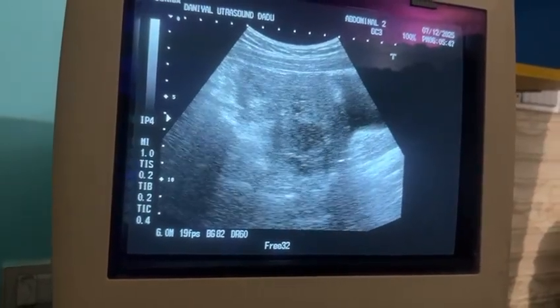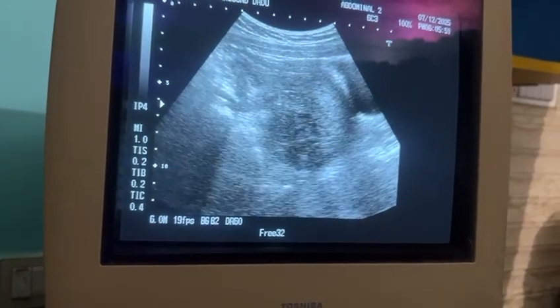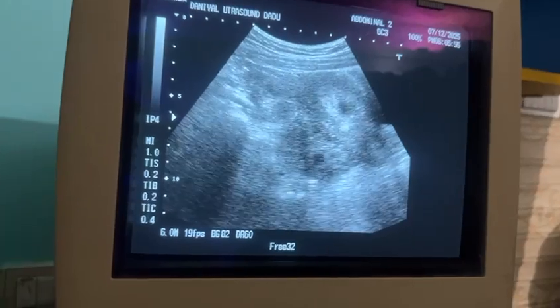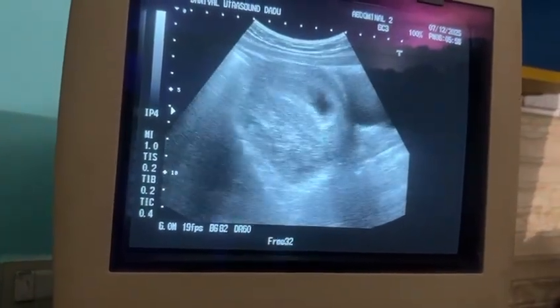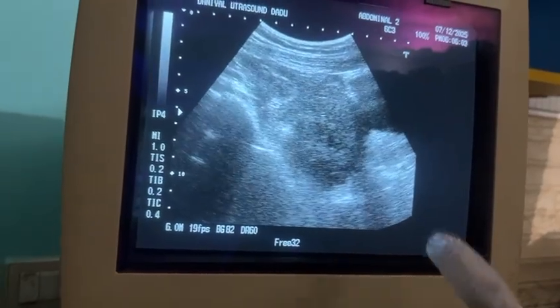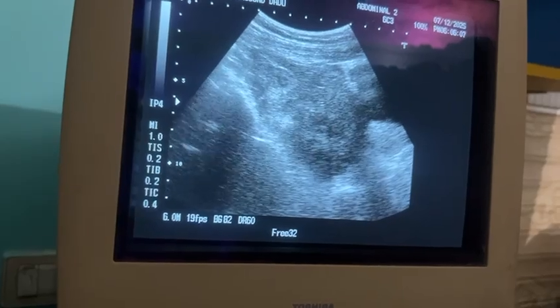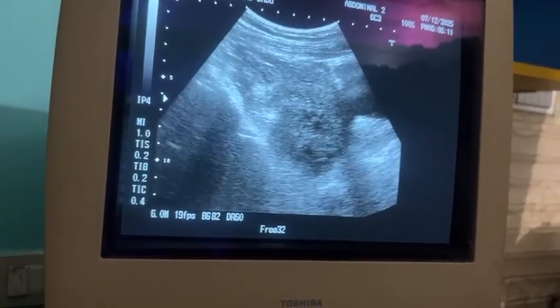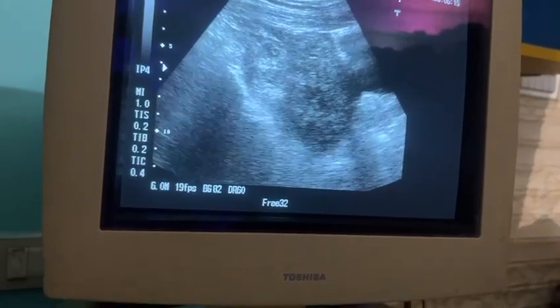Sometimes I have even observed a live embryo with the ruptured tube or ovary, which I have also recorded in previous lectures. Here there's only an amorphous mass occupying the posterior part and the right adnexal area. So these findings, along with clinical correlation, point strongly towards a ruptured ectopic.